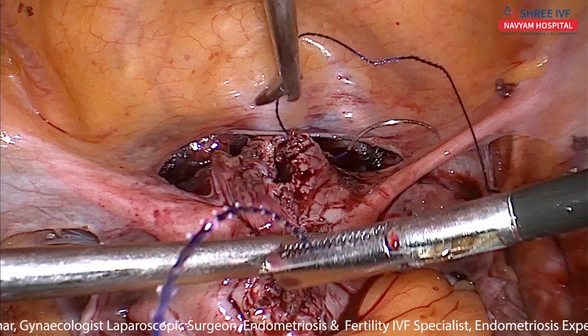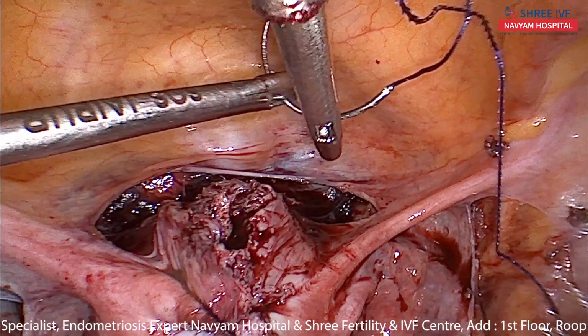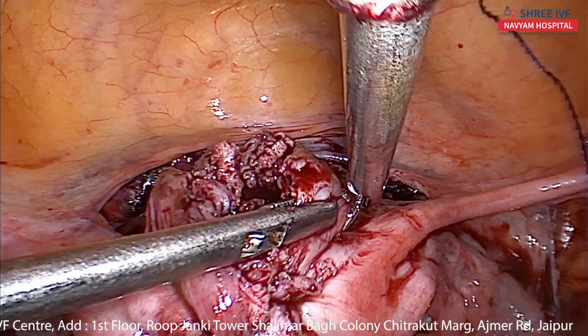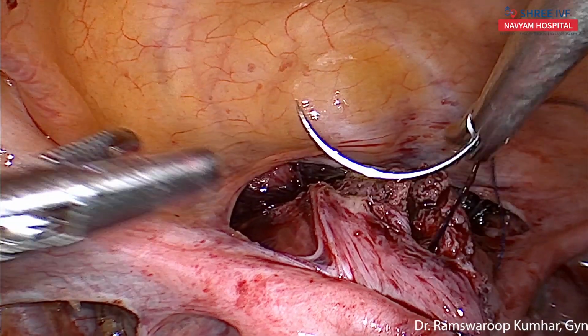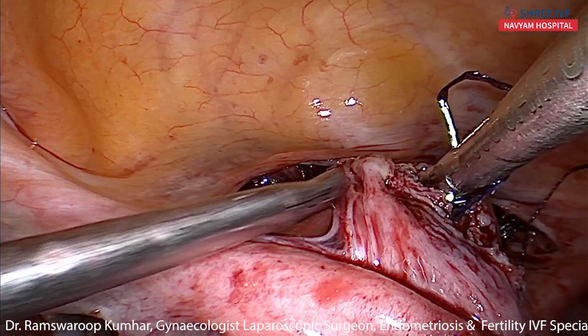This is slightly cut through because of the adenomyotic nature of this tissue. So we have to be careful taking deep bites. Taking deep bites on this side also.